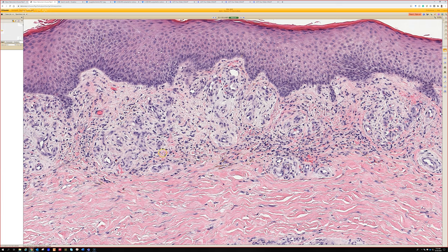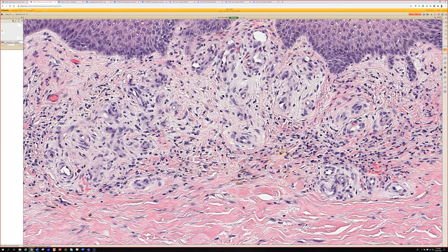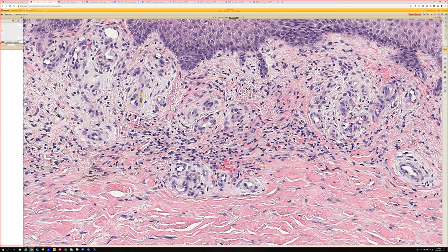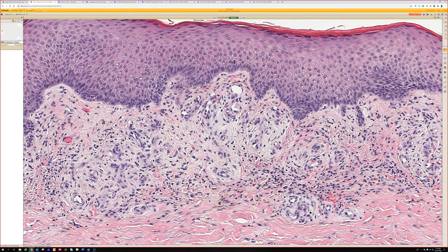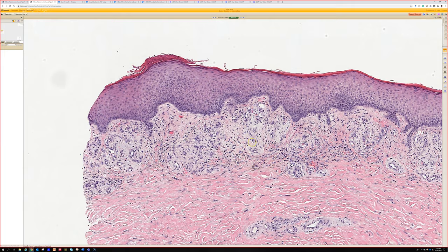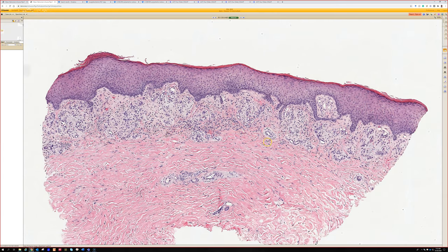Pigmented purpura is the other thing that can look kind of like this, but I want to see more lymphocytes for pigmented purpura. There are some eos scattered in here. On any lower leg biopsy from the shin, I will find you an eosinophil — usually multiple. I kind of wonder if it's a special site for eos. Occasionally stasis can be so severe that it begins to get a lot of spindled fibroblasts — it can then mimic Kaposi sarcoma, both clinically and microscopically. We call that pseudo-Kaposi pattern acroangiodermatitis, which is basically a severe form of stasis. You can easily do an HHV-8 stain.